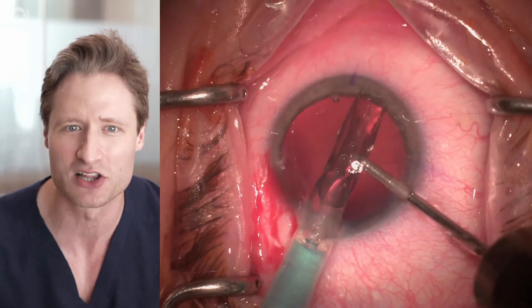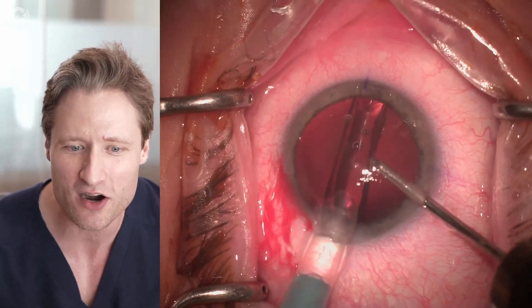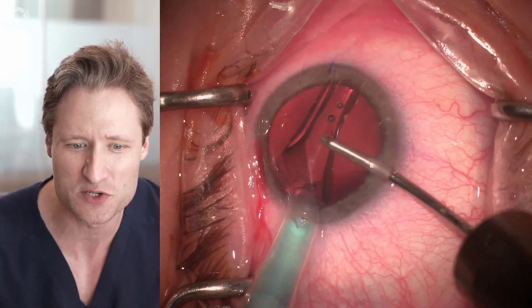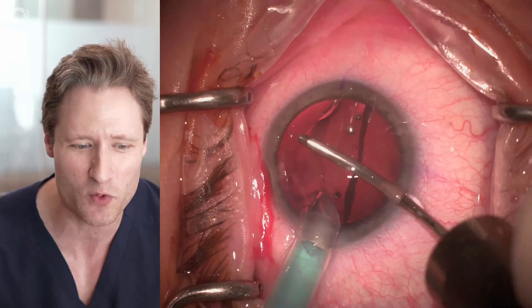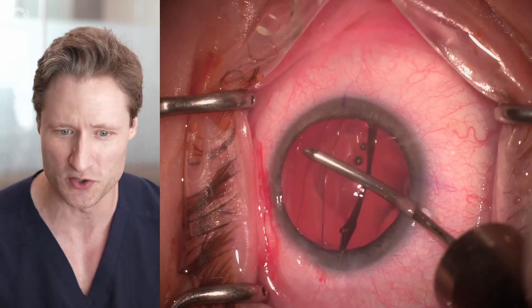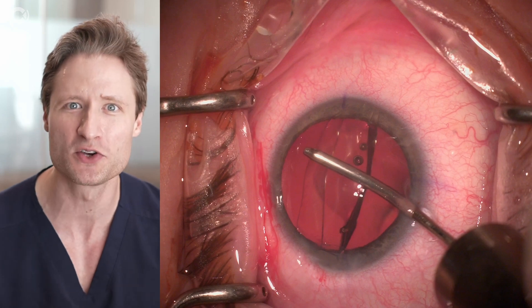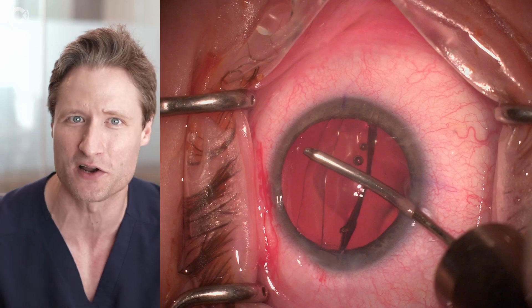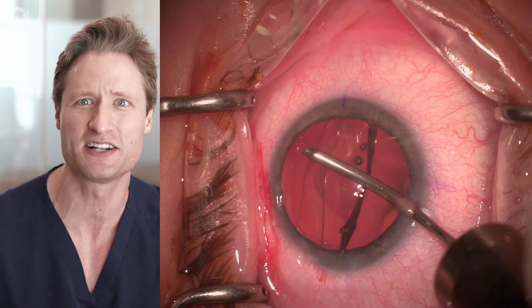This is a hydro implantation using an irrigating handpiece through one of the paracenteses. The lens is brought to the mouth of the main corneal incision and injected into the eye. The irrigator maintains the volume of the anterior chamber — but as the lens glides out, it begins to rotate, flip sideways, and ends up on its side. What happened, and what do we do?